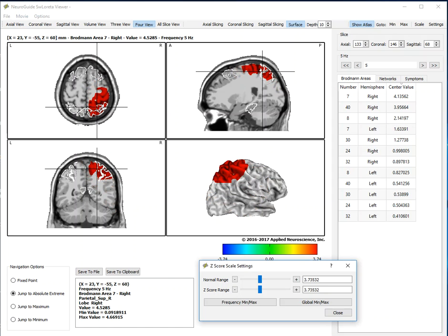Networks, symptom checklist, the ability to create a .SO5 file. So now you can rapidly go from an assessment using SW Loretta to the neurofeedback protocol.